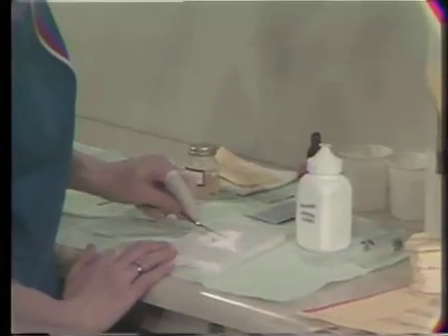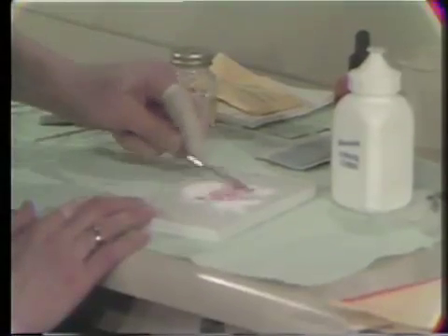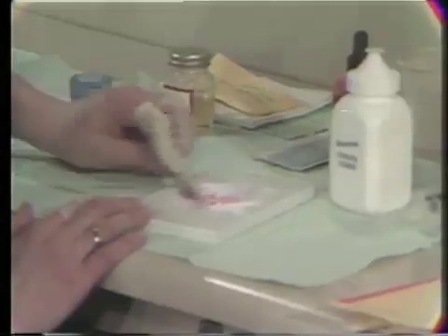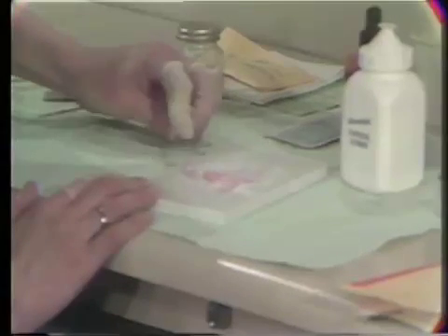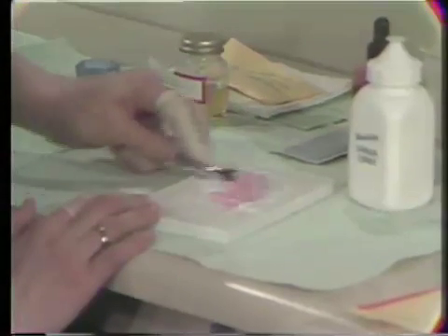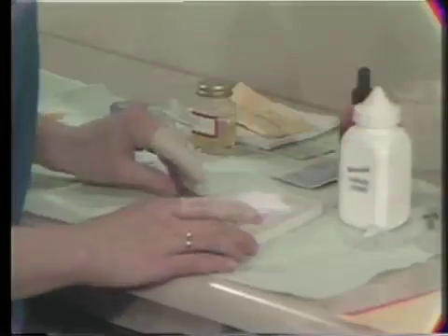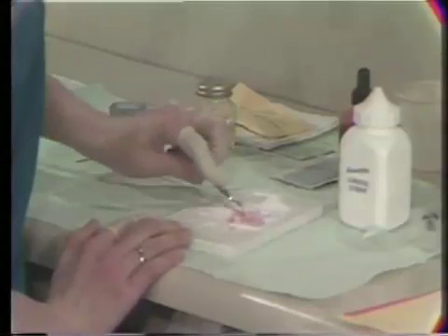And this is Ward Wonder Pack dressing material that will be placed in Harry's mouth. And you can see how she rapidly incorporates the powder into this dressing material. One of the most critical aspects of this type of periodontal dressing material is to make sure that it is mixed relatively thick, and that after it's mixed quite thick, it's rolled into a rope maybe 1/3 to 1/4 the size of a pencil, and that there's a lot of powder on that rope.